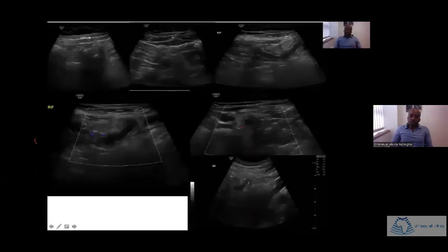So this was the ultrasound. The cecum up here, top left, appeared normal. So that's the normal cecum there, with normal wall thickness and lumen, nothing exciting there. You can see the terminal ileum also appeared normal. The ileocecal valve is somewhere here. So that all comes into the cecum, and this continues from the distal ileum. You can see the luminal gas there in the normal terminal ileum.